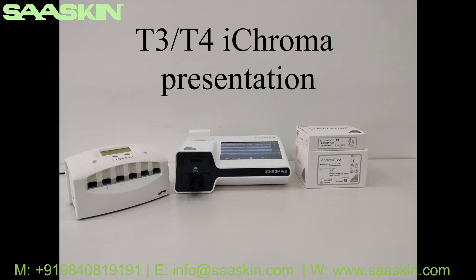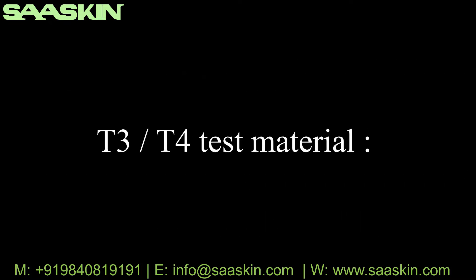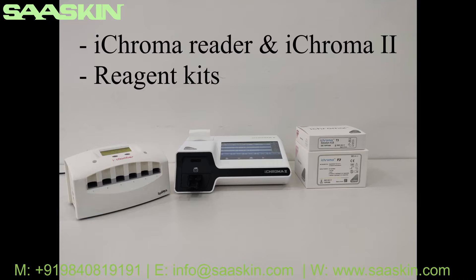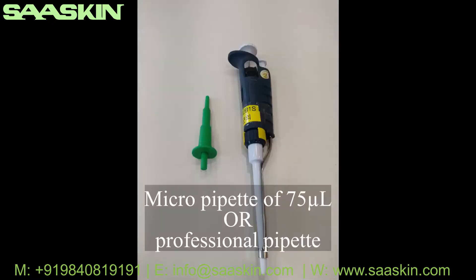T3 T4 ICHROMA presentation. Please note that the T3 and T4 procedures are the same, therefore you can use this video as an example for both tests. T3 T4 components: ICHROMA reader or ICHROMA II, reagent kit, detection buffer and solution B, and a micro pipette of 75 microliters or professional pipette.